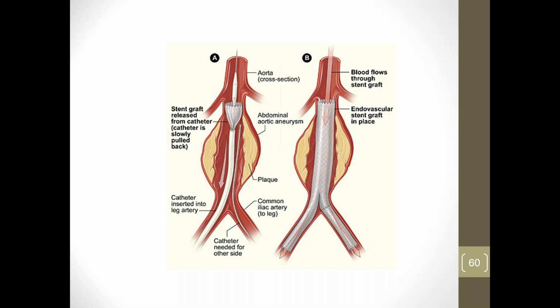It's all bundled up, and then there's a balloon under it that pushes it out, and then they keep expanding the balloon until it literally drags itself, because the stents actually have little barbs on them, and the little barbs will actually go into the walls of the aorta. The catheter itself is not very big, right? Oh well, that one is though. It's small for what you're thinking you're going through in the femoral artery, but it's big compared to the little guys they use in the cath lab and IR. So it's kind of a neat thing to see.